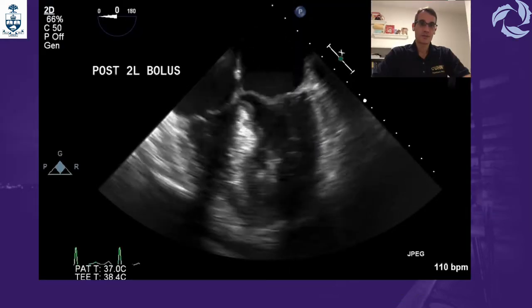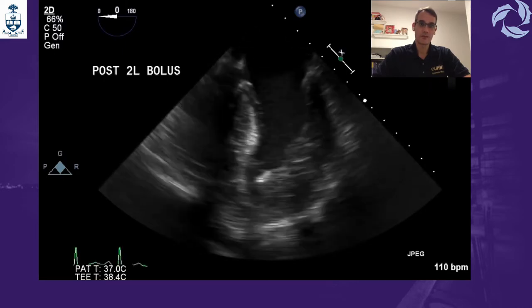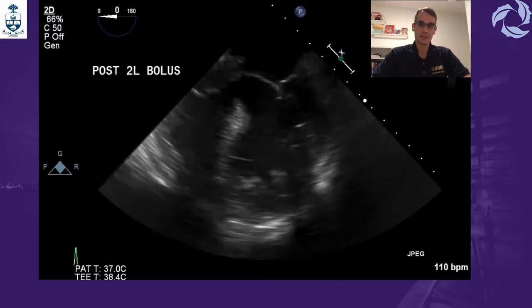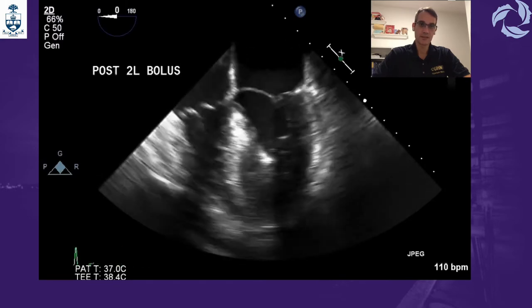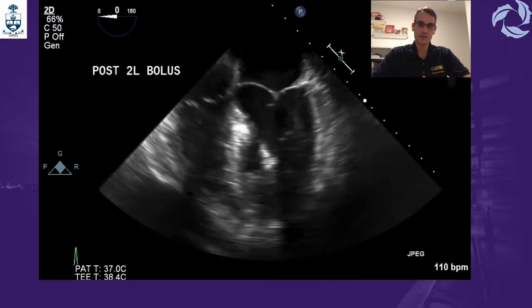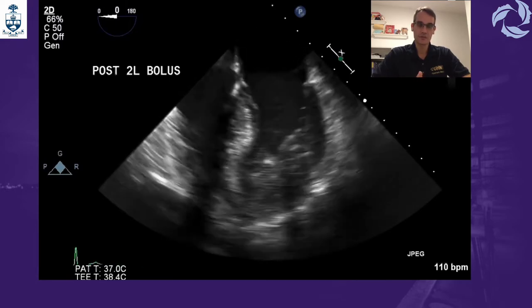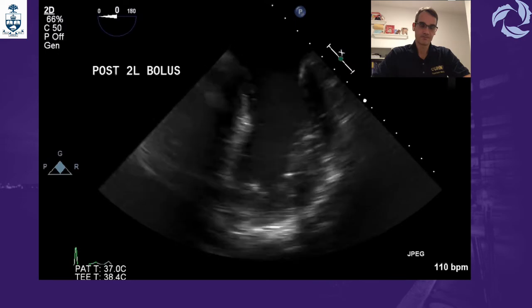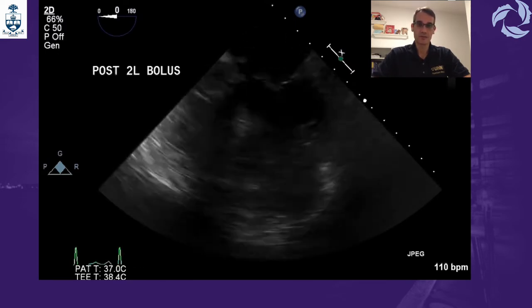In this situation we decided to give another liter of volume, which provided some improvement but the ventricle remained very hyperdynamic. Our recommendation was to run an esmolol infusion to slow down the heart rate and fill those patients adequately. The patient did well after the surgery.